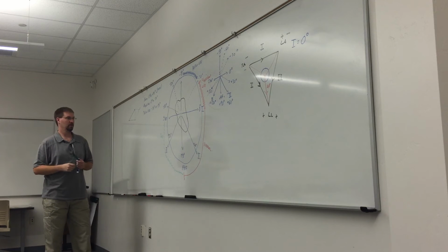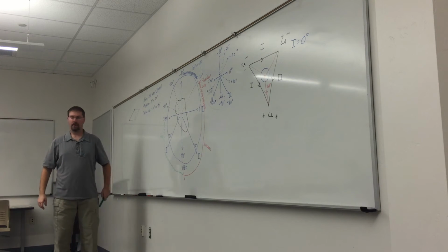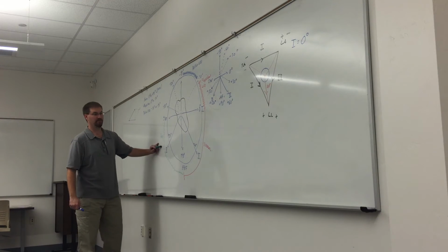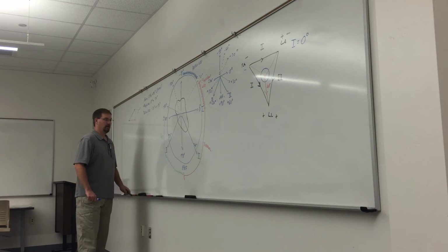It's not patho, it's not... No, we just call it RAD. It is pathological, but it's not a subset of normal. There's no physiological RAD, if you will. You guys cool with that?